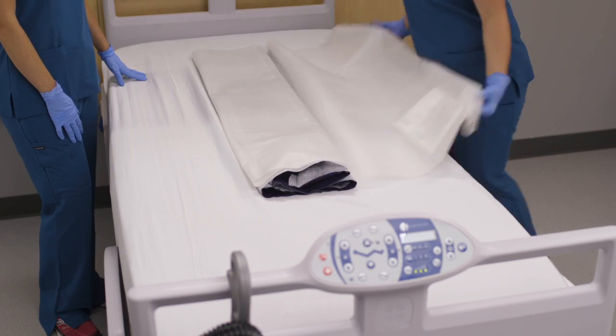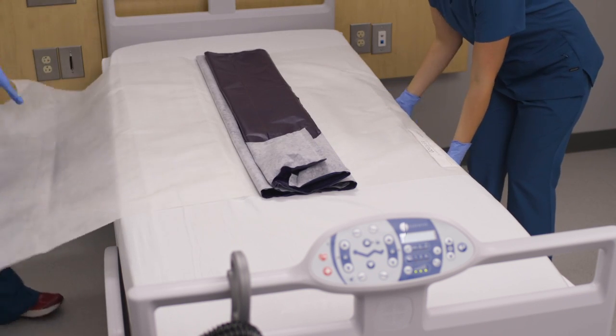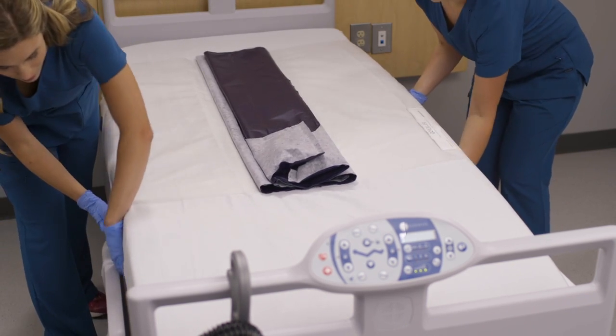The Q2 Roller is constructed of breathable material to prevent moisture buildup and enhance patient comfort. The bottom layer is the securing apron, which is placed under each side of the patient's mattress to secure the device in place.